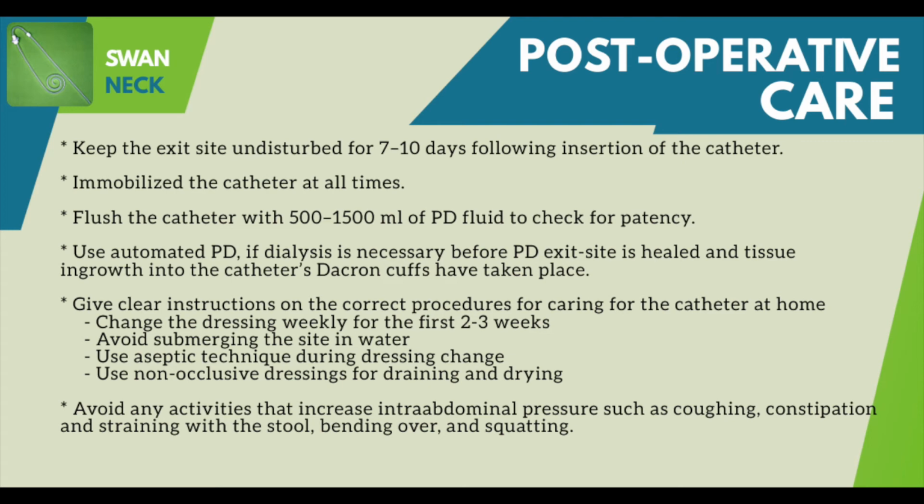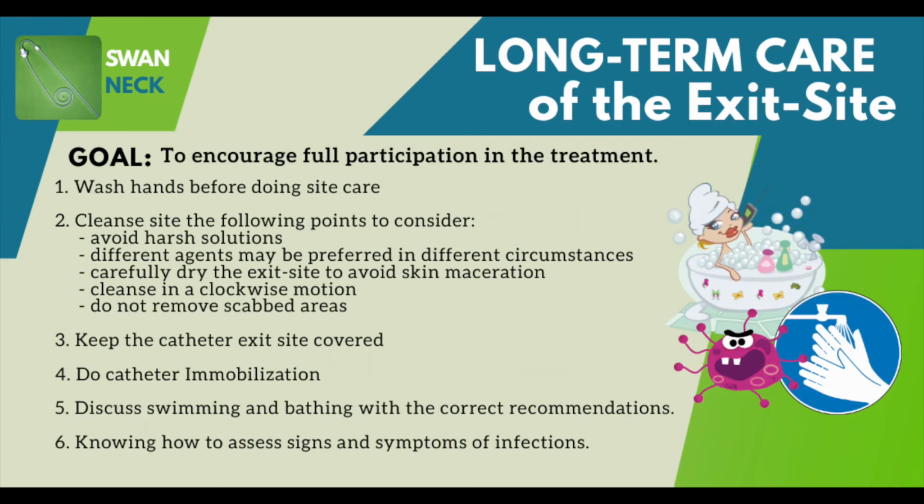Also avoid any activities that increase intra-abdominal pressure such as coughing, constipation and straining with the stool, bending over, and squatting. The long-term care of the exit site goal should fit the lifestyle of the patient to encourage full participation in the treatment and therefore reduce the risk of complications.